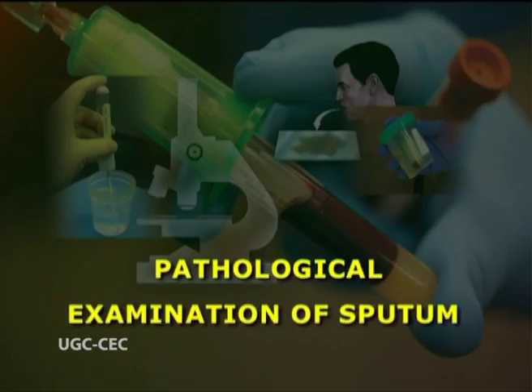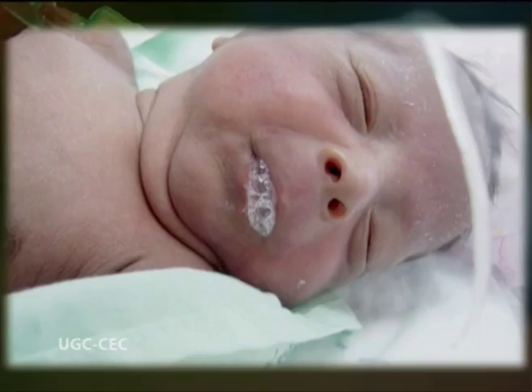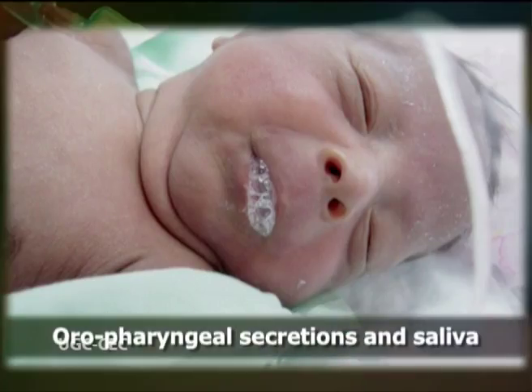Pathological examination of sputum. Good quality sputum samples are essential for accurate microbiological diagnosis of pneumonia, but also acute tracheitis and bronchitis. Samples contaminated with oropharyngeal secretions and saliva are difficult to interpret and can be misleading.